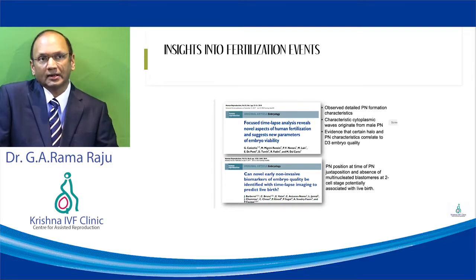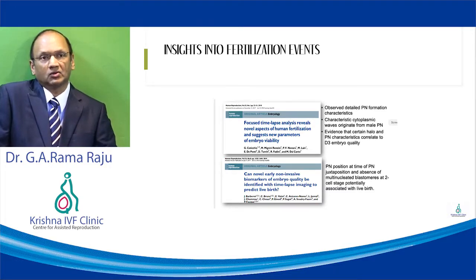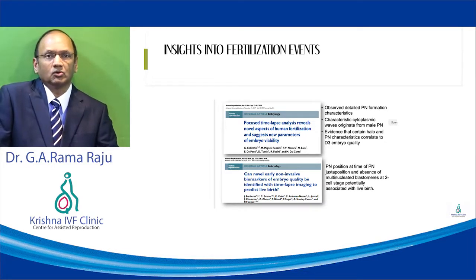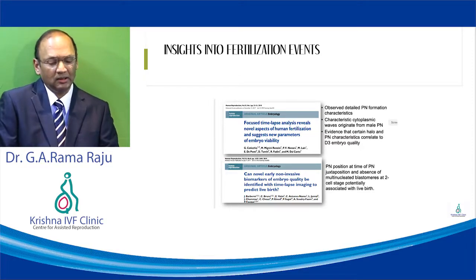So, the evolving technology is moving from minimizing the number of embryos and also predicting their implantation potential, so that with time we will be able to reduce the number of embryos we are going to transfer and also select the optimal embryos.